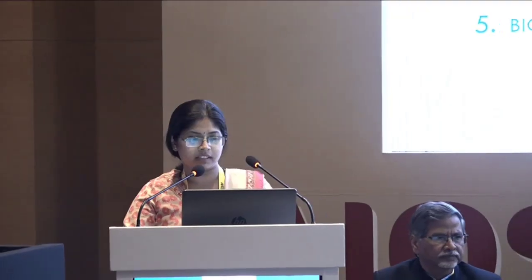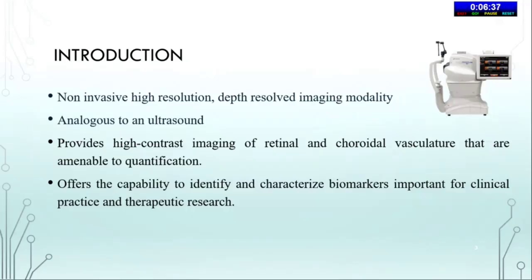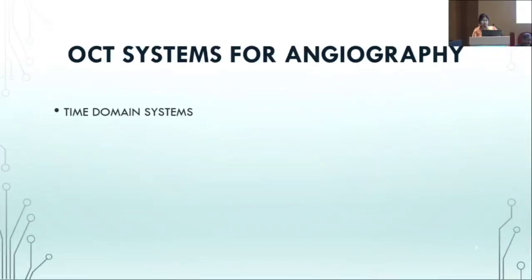I will be discussing in brief about OCT angiography, its artifacts, the retinal biomarkers that are already described in OCT angiography, the novel methods of analysis, and biomarker-free diagnostics. It is a non-invasive, high-resolution, depth-resolved imaging modality analogous to ultrasound. It provides high-contrast imaging of retinal and choroidal vasculature that are amenable to quantification. It offers the capability to identify and characterize biomarkers important for clinical practice and therapeutic research.